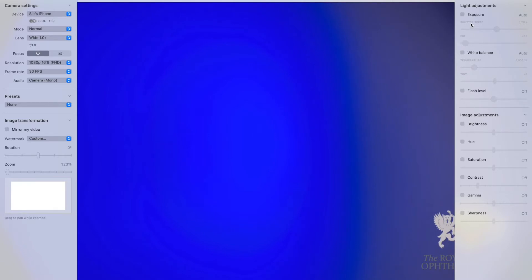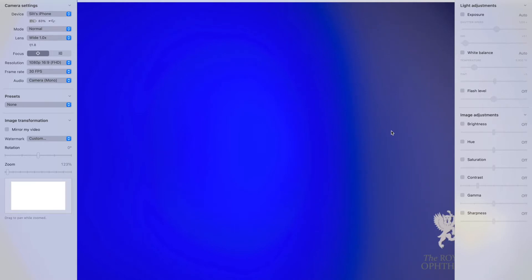Examining different parts of the eye requires different levels of exposure and white balance to have the optimal image. For example, you need to increase the brightness and exposure for examining the cornea, whereas a lower brightness and lower exposure allows you to appreciate retinal details more clearly. I was able to change and modify these settings on the fly whilst Mr. Ferris examined in real time.